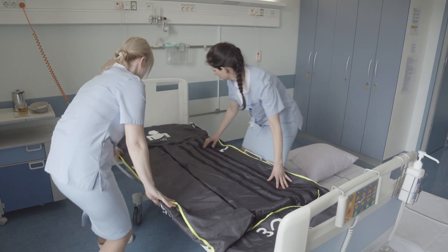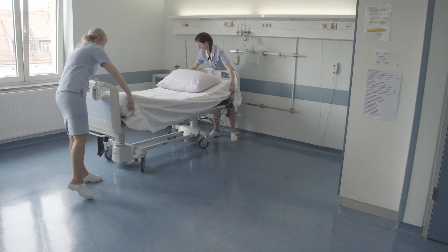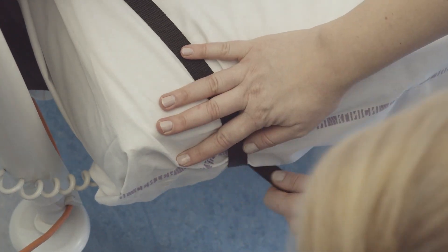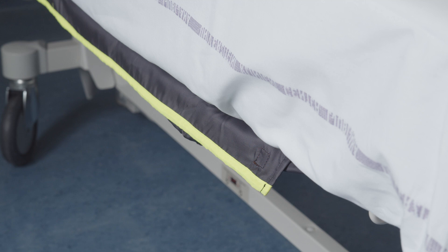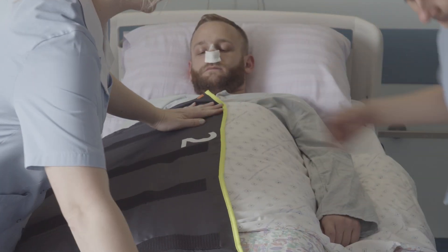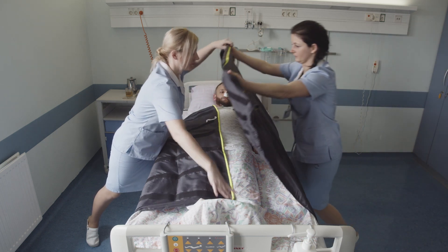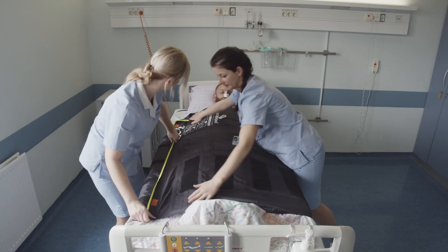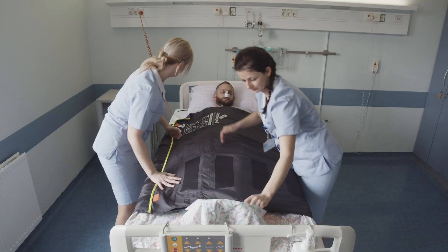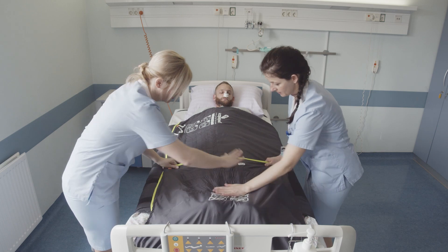Place the evacuation mat on the bed frame and carefully place the mattress on the mat. Attach the evacuation mat to the mattress with the elastic band. The mat is ready for use. If evacuation is required, pull the left side of the evacuation mat from the mattress and place it over the patient. Pull the right side from the mattress. Pull the sides together. Attach the right side to the left using the Velcro. Tightly fix the sides.